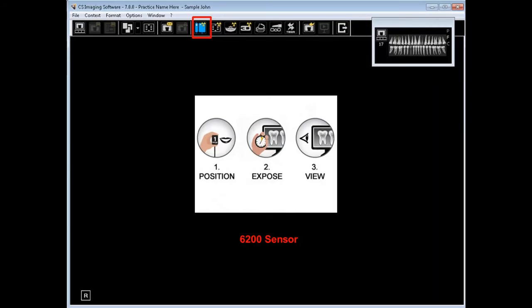The 6200 sensor, once plugged in to the USB dock and it's been recognized, the sensor icon will turn green and it's position the image, expose, and view.